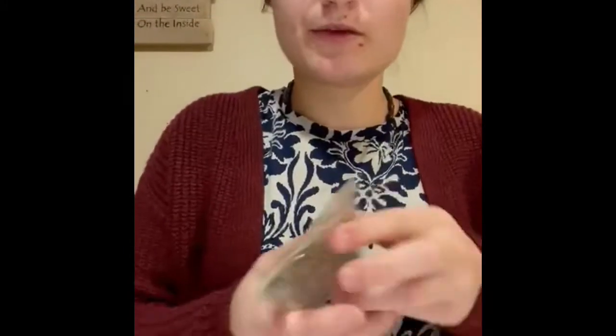Now I'm going to do my third check, my bag with this, to my vials, to my MAR, and whatever information I got from my IV guidelines.